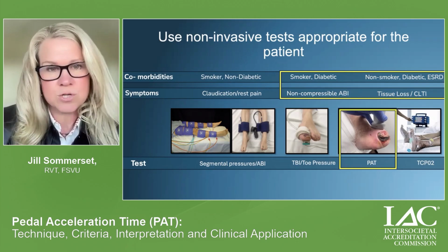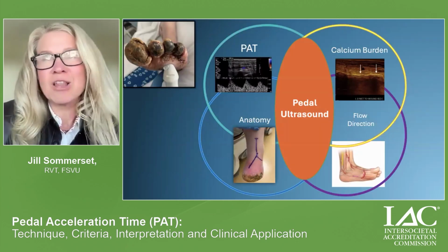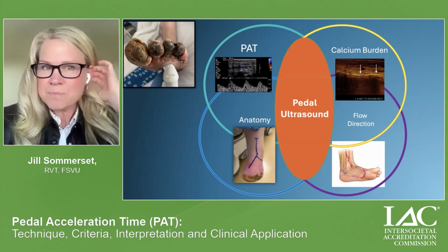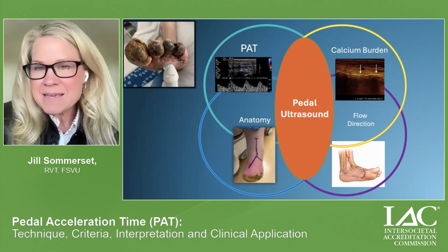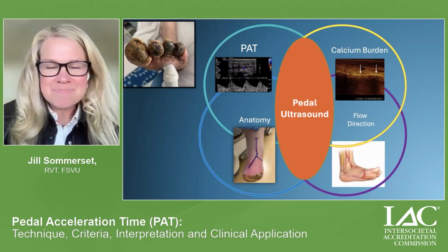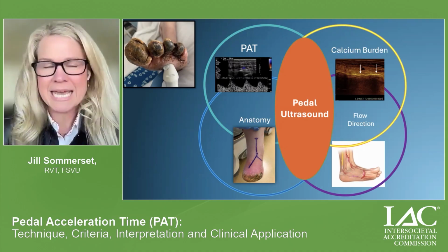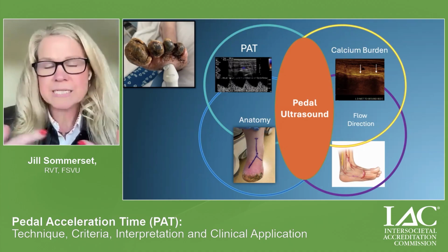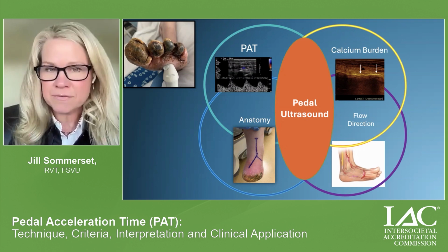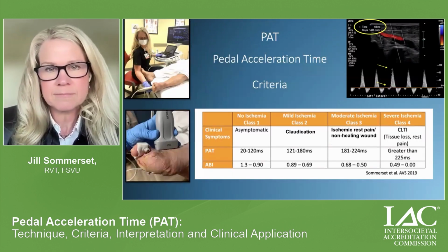In patients with CLTI, missing toes, forefoot amputation, pedal duplex is a really helpful tool in assessing perfusion. And it's really nice because pedal duplex really unlocks so much information. We can not only look at perfusion, we can understand the anatomy, we can evaluate the calcium burden, and we have the ultrasound tools to understand hemodynamics, antegrade, retrograde, direct, indirect flow to the wound bed. And that really tells us a lot of information of the status of the patient.